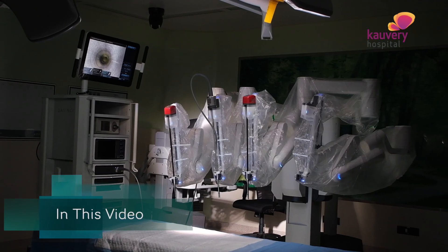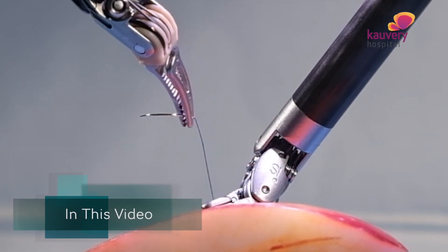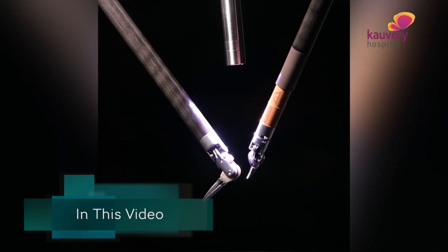What is endo-wristed surgery? This is endo-wristed. There are two or three joints, and that is why we can use our hands in different directions.